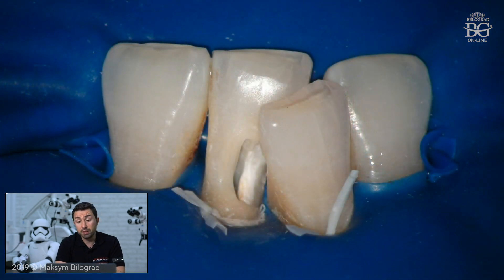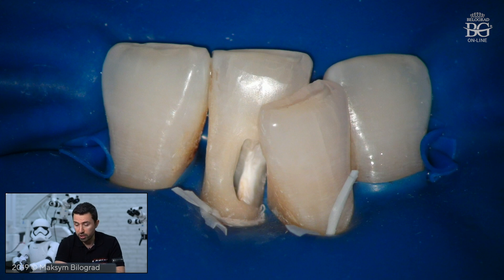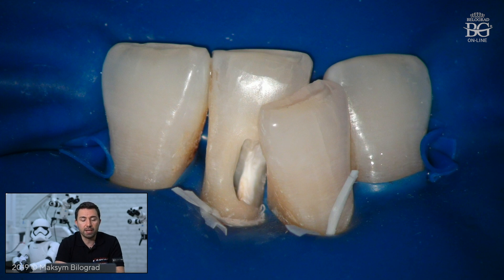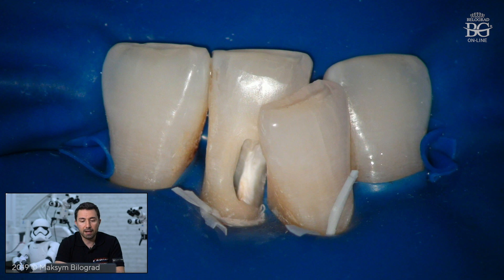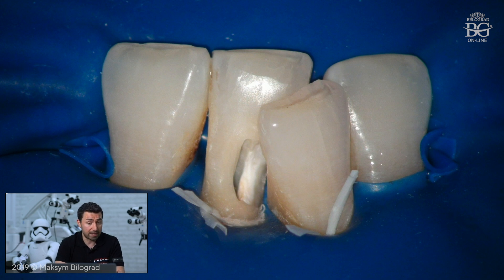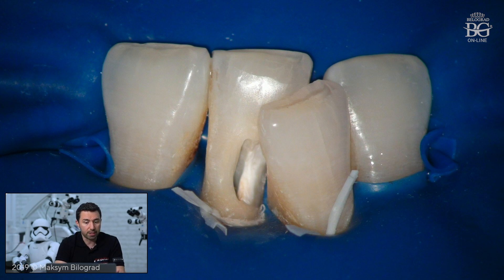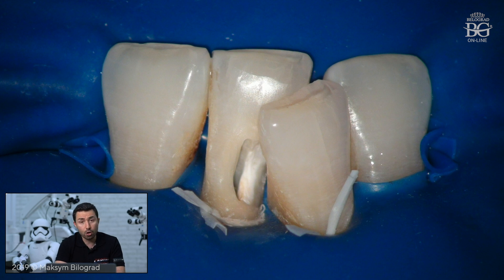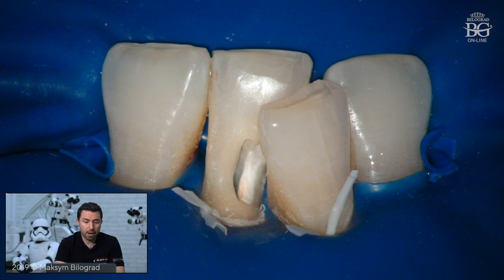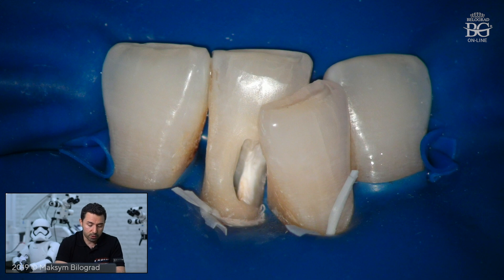This is the end of endodontic treatment. You can see the access was super conservative but extreme. I want to highlight again that this is not an access taught in universities, because it goes against classic endodontic rules. If you decide to do this access, you must understand the big risk you take. But if you know how to utilize proper instruments, these cases can become more predictable.